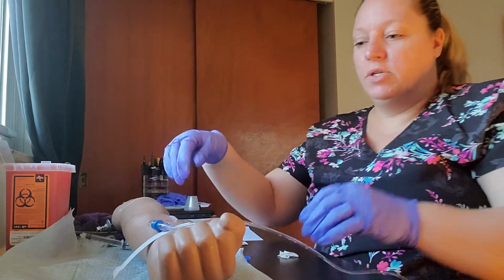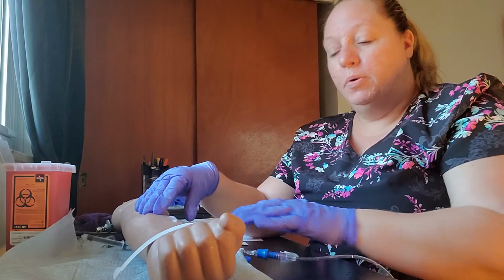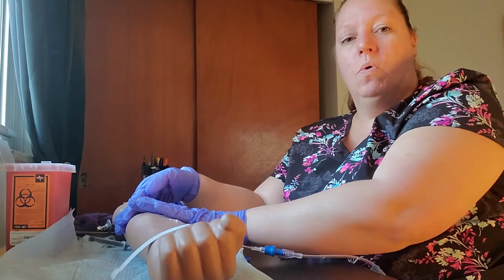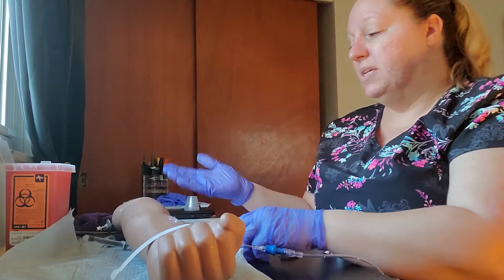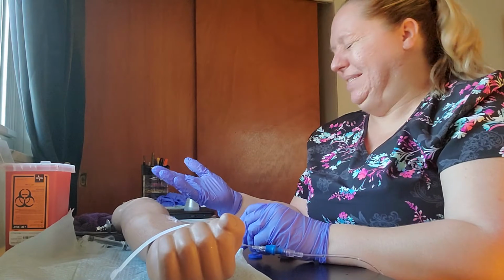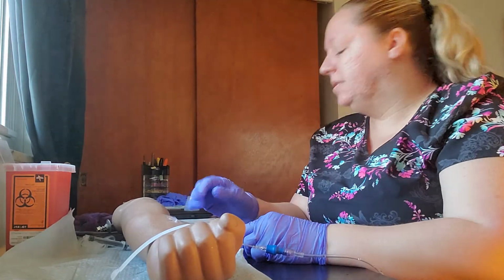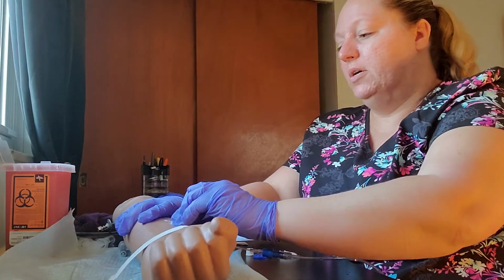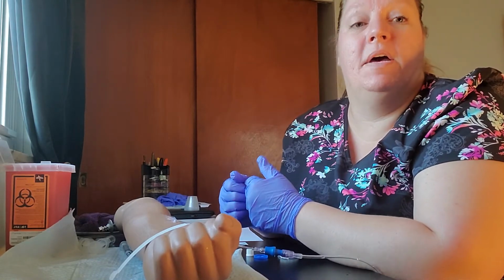Again, I want to make sure that I'm assessing this IV site even after pushing the medication through, just to make sure there's no redness, no warmth, no coolness, no infiltration. Mrs. Edwards didn't have any complaints with the injection of the medication. She tolerated it well. So my next job is going to be to go out and document on the MAR.